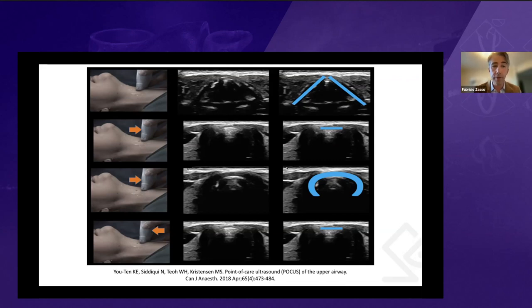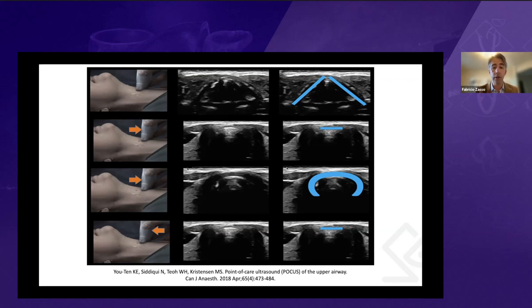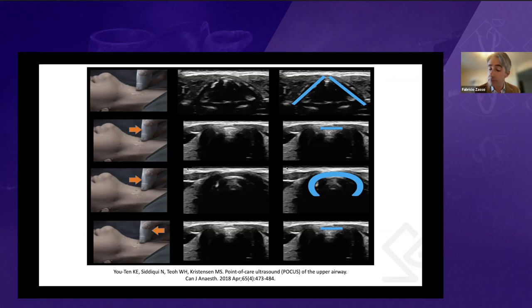For this transverse approach, if you're having difficulty finding the structure, you can start at the suprasternal notch, place the probe there to find the trachea first, and then move upward to find the other structures.